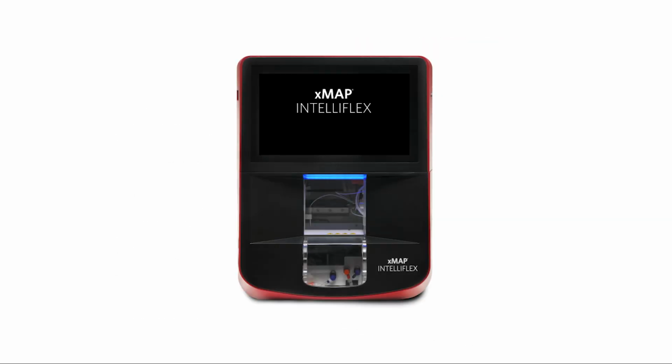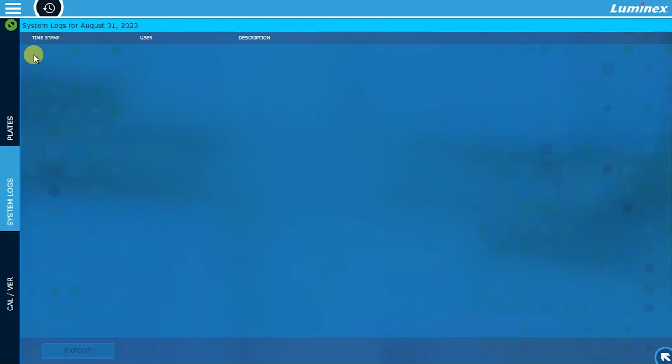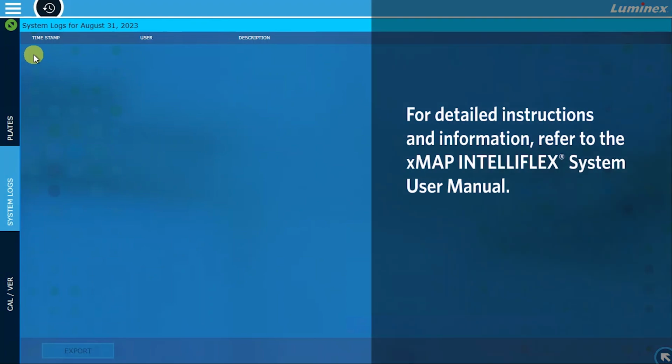The xMAP INTELLIFLEX system software is a graphical user interface application that is installed on the system's embedded computer. This overview describes how to use the INTELLIFLEX system software. However, this introductory video does not cover all program features in detail. For more detailed instructions and information, please refer to the xMAP INTELLIFLEX System User Manual.